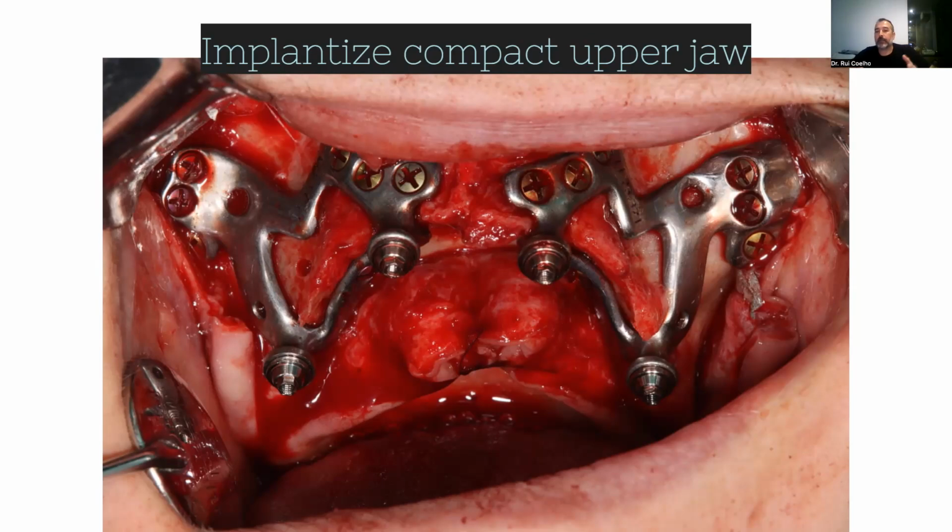We are always discussing zygoma approaches from the outside of the sinus because it induces sinusitis. The main problem is to have problems with sealing. If you have micro movements, tissue will not seal around the connections. And for sealing, we also do this constriction. We know nowadays that this constriction forces the formation of circular fibers that will protect against the infiltration of bacteria.